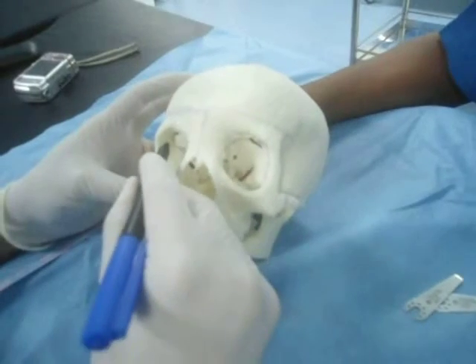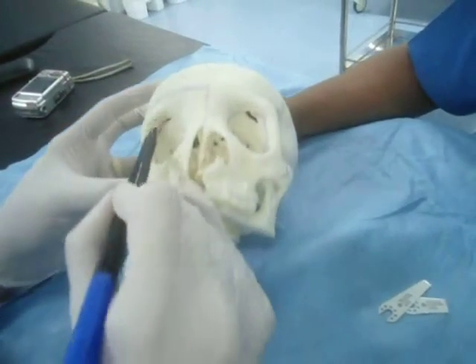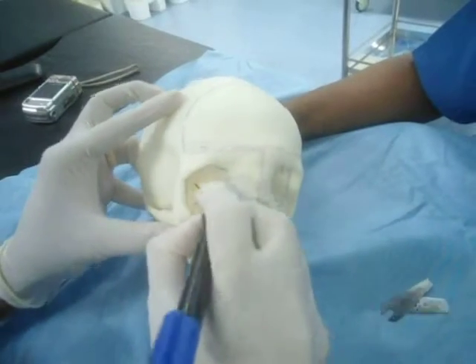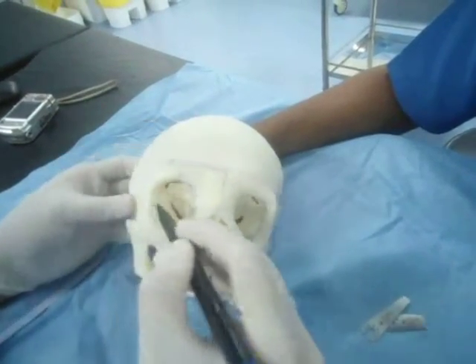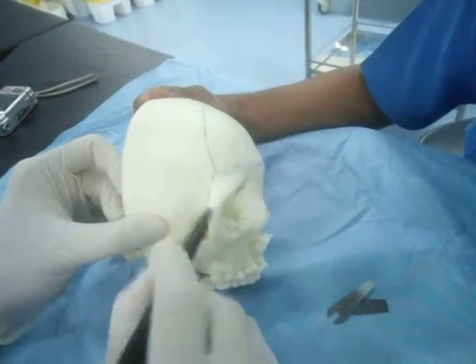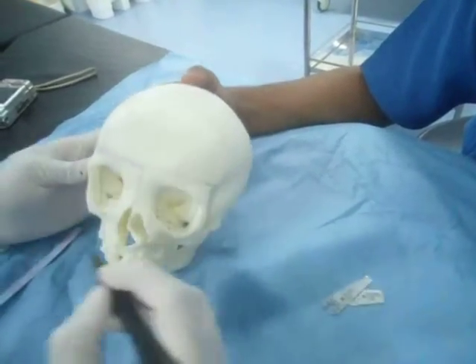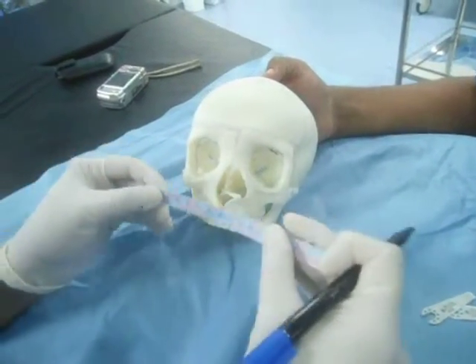Similarly, we'll mark the osteotomies on the other side, behind here, behind the lacrimal apparatus, and connecting the roof. So now we have marked the orbital osteotomies.